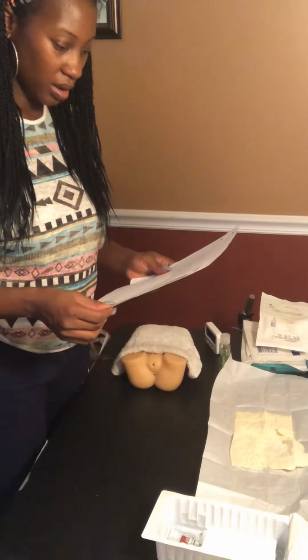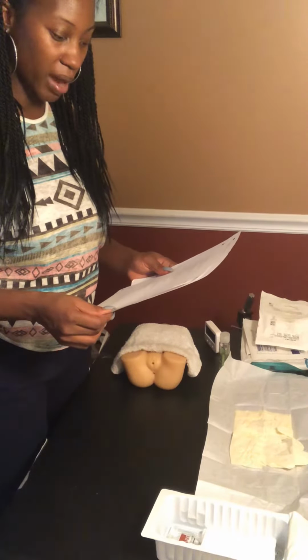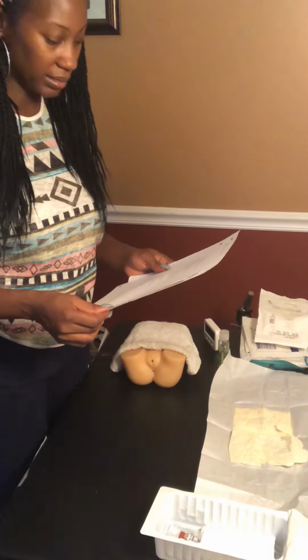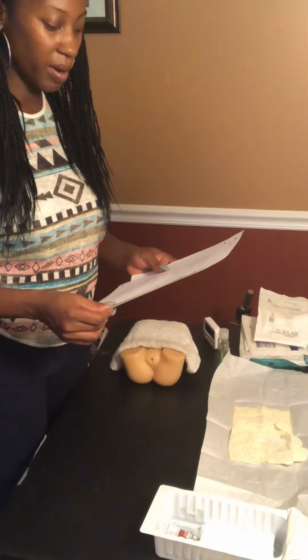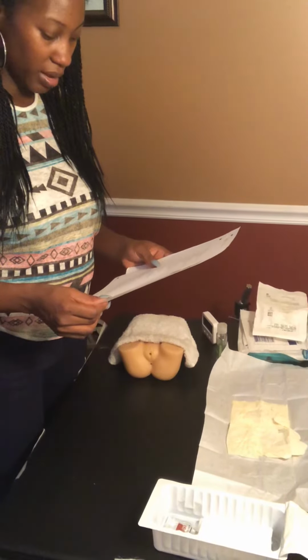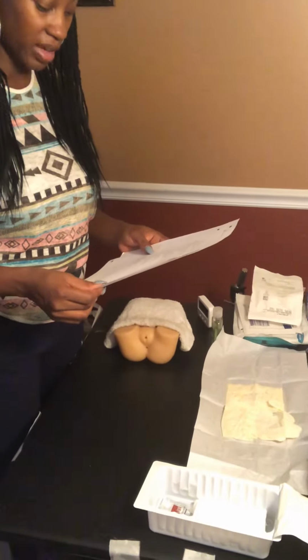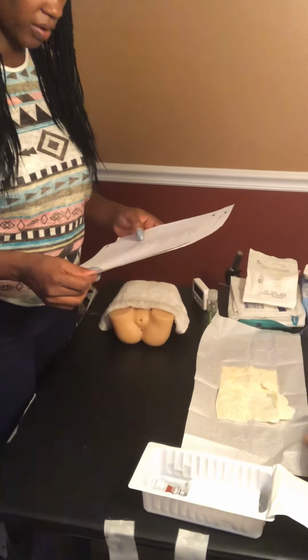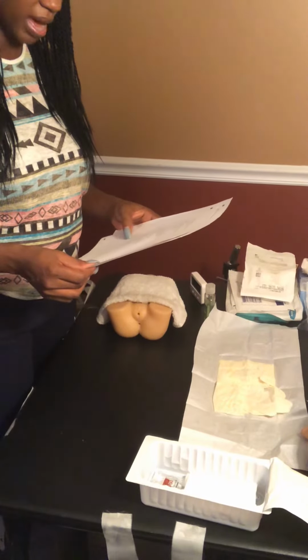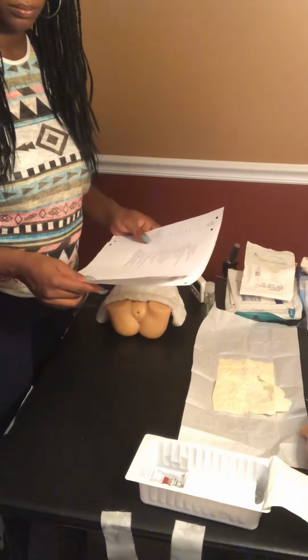And then we're going to withdraw the catheter, dry the perineal area with underpad, and discard the supplies. Document data related to urinary status, time of current catheterization, size of catheter. Complete the procedure within 30 minutes. Adhere to professional behavior. Perform procedure with allotted supplies.